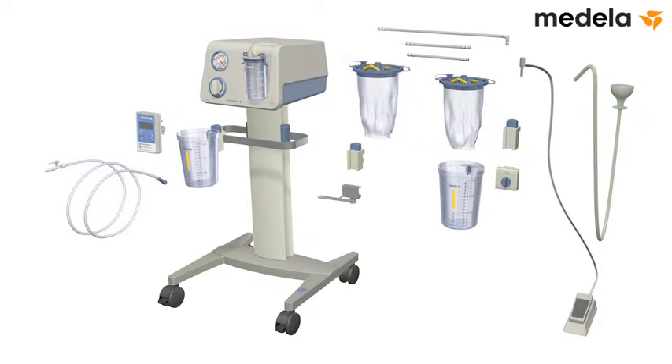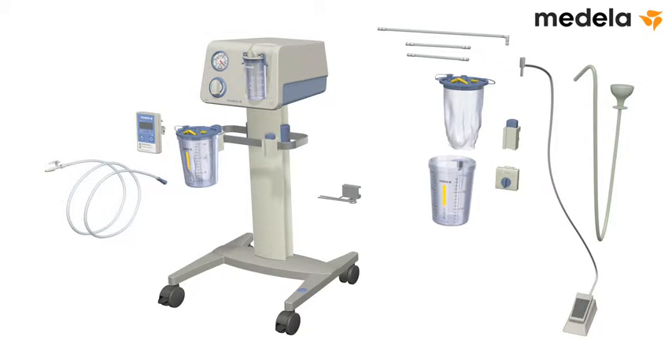Prepare a new 1.5 litre disposable suction liner. Insert it into the jar and press the lid on firmly. Repeat this process for a second jar.